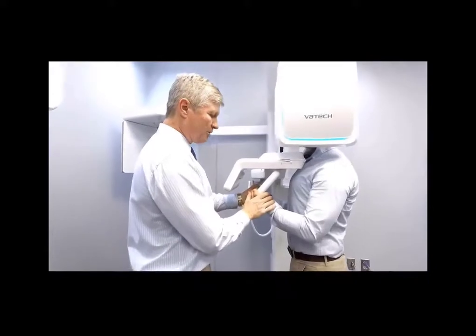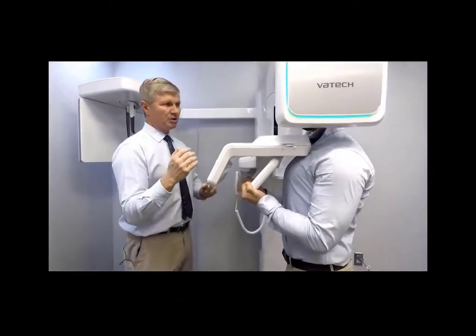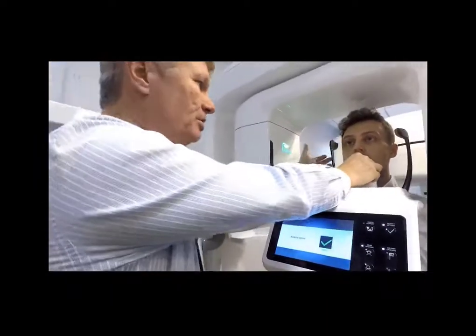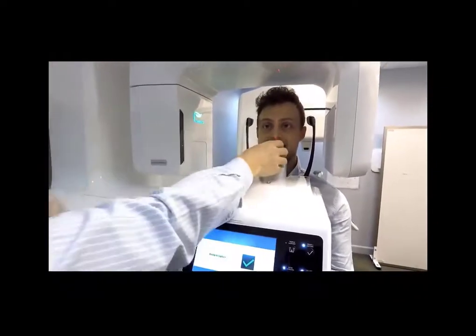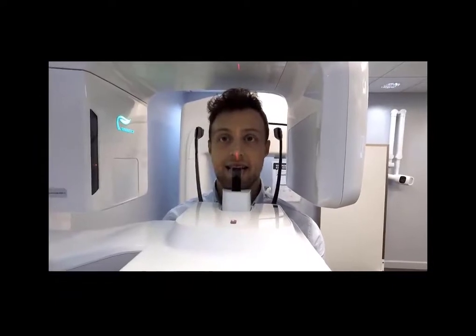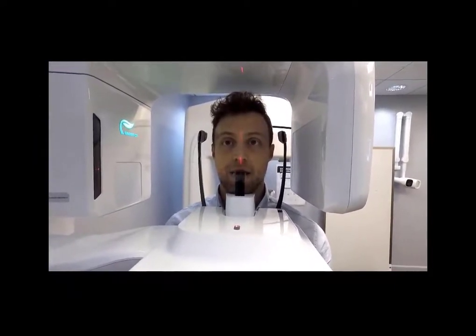Okay, hands are firm on the bar there, upper part of the body nice and close to the device here. As I come around to the front of the patient, I'm going to pick up the bite stick just a little bit, and come on forward and put your chin on the chin rest, bite down on the bite stick, and also pull down on the bite stick too, to make sure the chin is firm on the chin rest there. Okay. At this point, go ahead and close your lips like you're sucking on a straw for a moment.